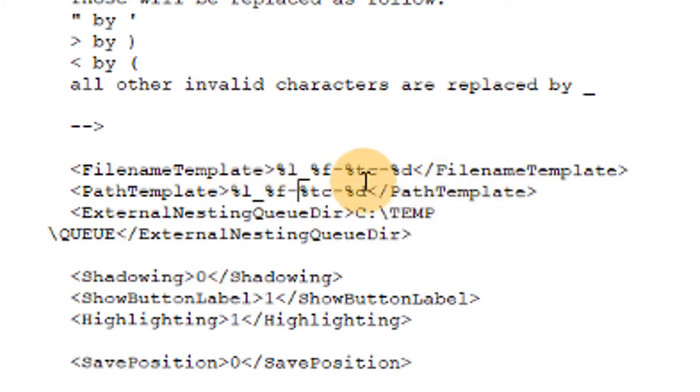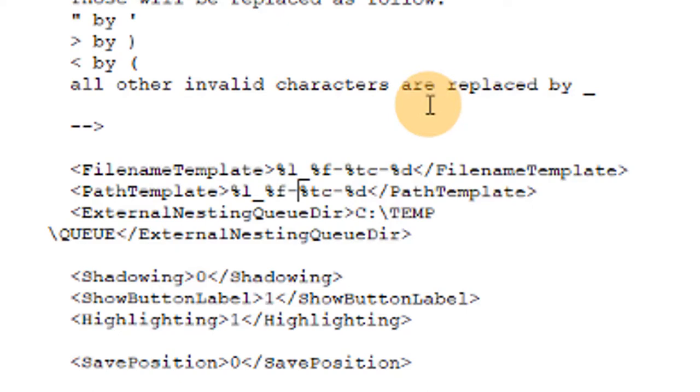So when you change these, that's going to change how your projects are saved within the CAD data folder. So you can put some patient information in there, help you find some projects without having to load up ExoCAD.